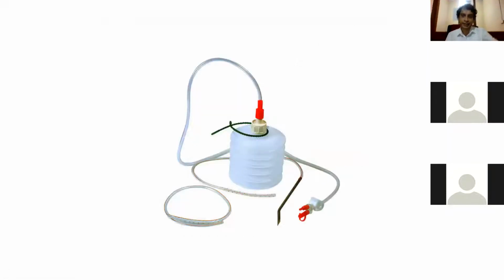Then we have this kind of suction drain, right? As you can see, this bit of the drain is like an accordion. You can apply suction by removing the bottle at this point and then squishing it like this. You can just press the bottle like this, squish it and then connect it to this, and then there's a suction vacuum there.